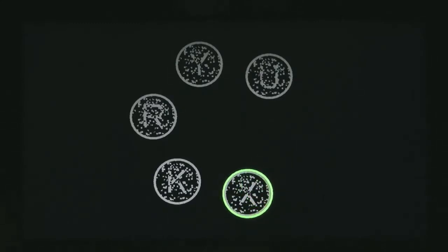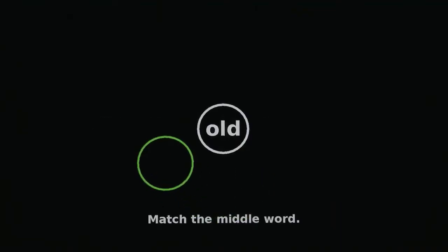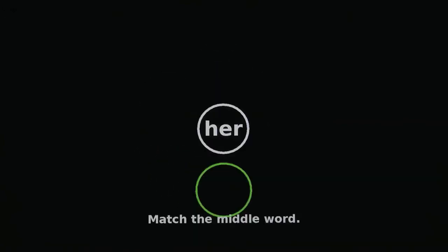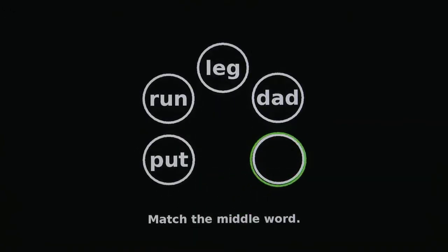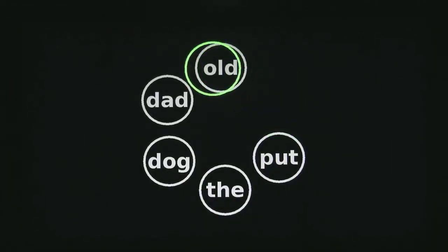After the initial presentation of the correct letter, a series of incorrect letters are presented at varying sizes and periods of time. The word memory test follows the same pattern. As with the rest of the tests, it begins with 3 transitional trials before the test begins. Once the patient achieves a certain level of difficulty, the masking is introduced. The number and duration of masks presented is determined by the level of difficulty achieved by the patient.